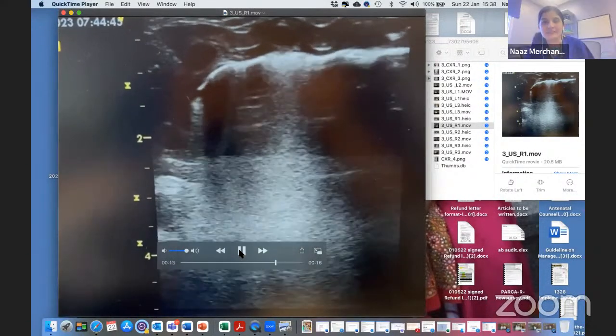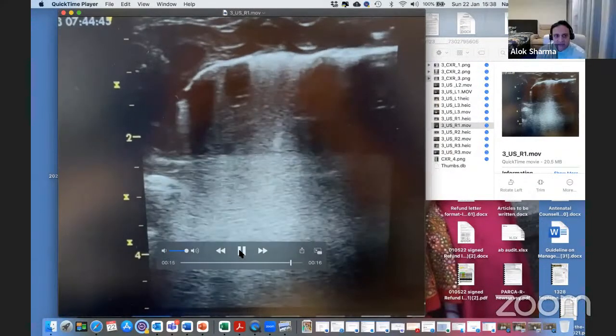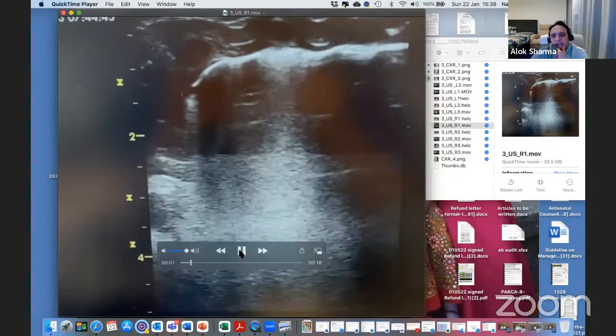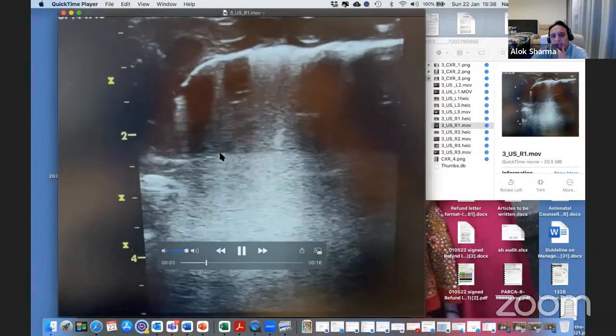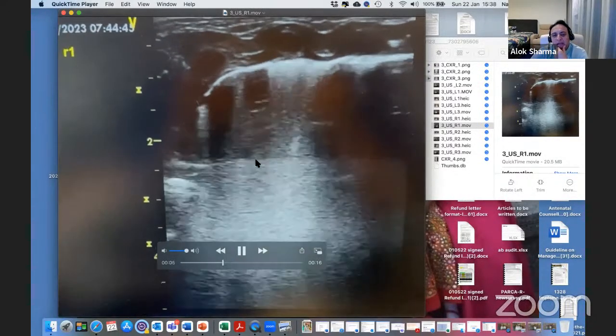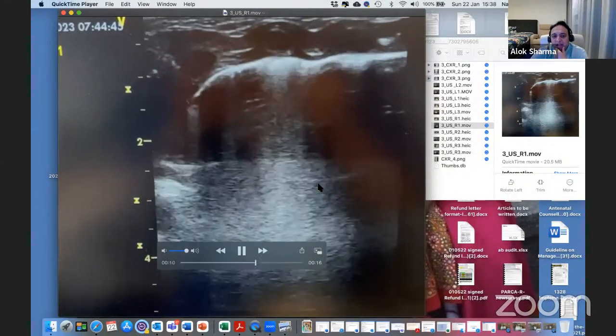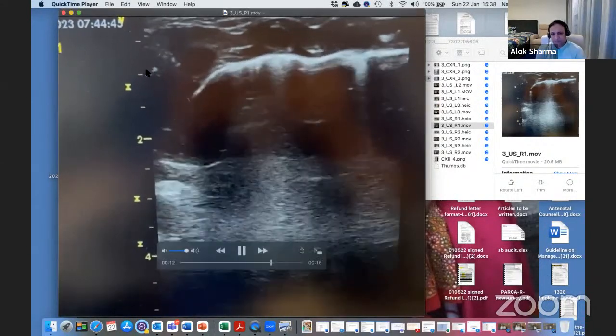Yes. So you've been able to aerate the right lower part of the lung as you move down. What you can see is a transition zone between the upper and lower lung, with pleural sliding throughout. If we play it again, you can see the lower half of the lung having pleural sliding with a B line even in the lower half. Now, this is obviously anterior, so clearly it's less wet. We can go to your next image.